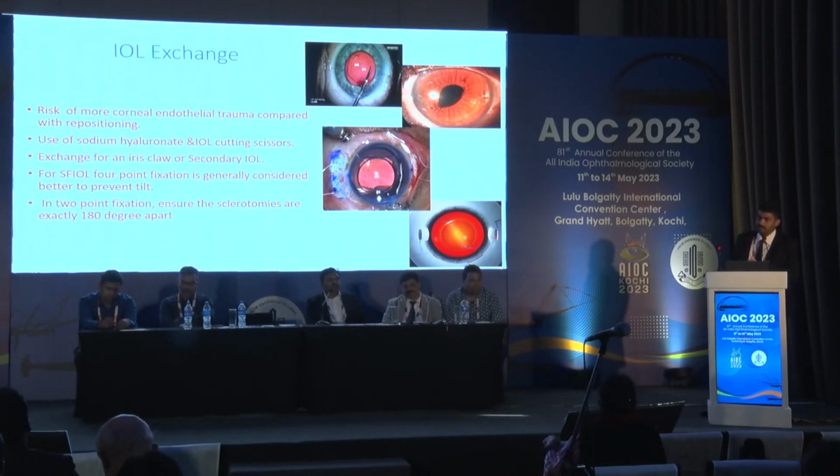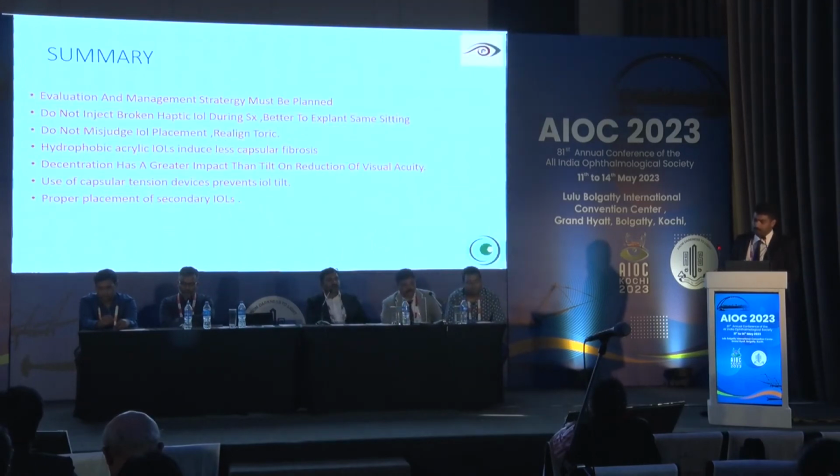And in some patients, if the patient absolutely disagrees to go for an IOL exchange, a pupilloplasty could also be an option. That could be a less invasive option. We have done it in 1 or 2 cases, and patients are relatively better after the surgery. Thank you very much.